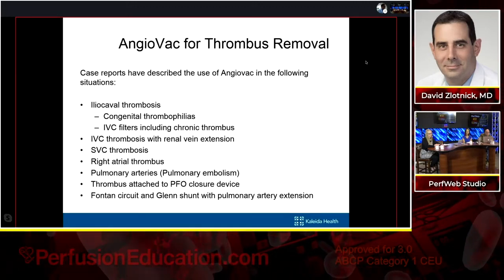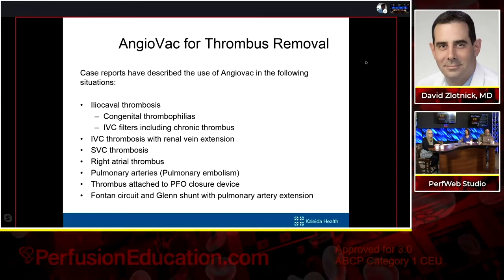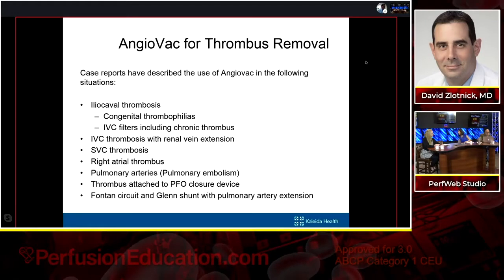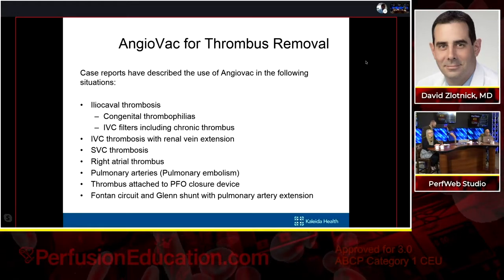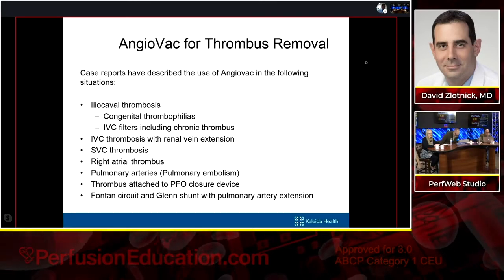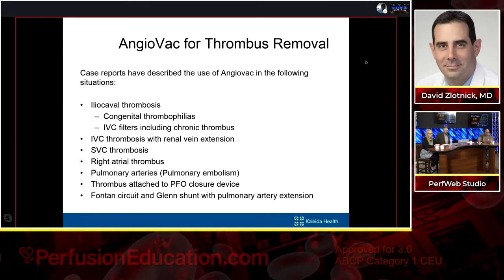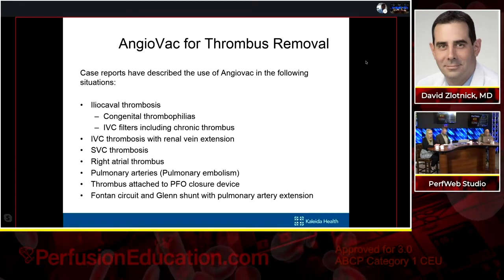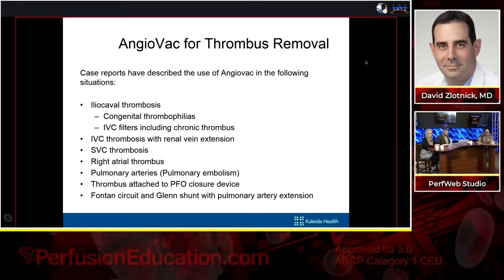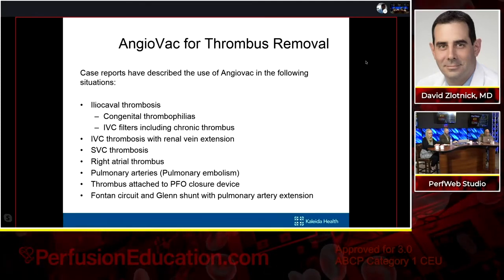atrial thrombus. Pulmonary embolism, though it was created for pulmonary embolism, early on, the success rate for the use of the AngioVac device in its current iteration for pulmonary embolism is less than 15%. So really, that indication has kind of fallen by the wayside. Thrombus attached to intracardiac devices, including PFO closure devices, as well as for congenital heart circuits, is what it's been used for.